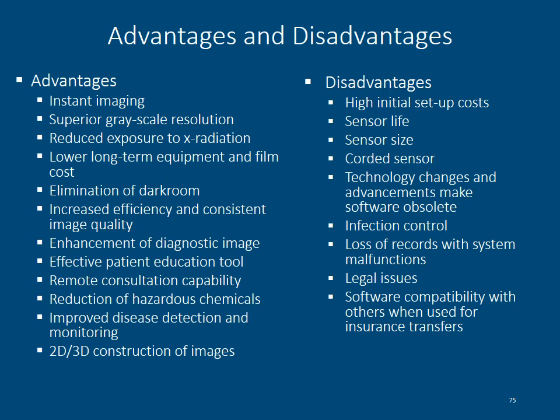The ability to send these images via the internet or digitally to another office, or to be consulted or reviewed by another dentist off-site, is a definite added benefit to digital imaging. It improves disease detection and monitoring because of all these other advantages. And it turns a 2D image into a possible 3D image. When looking at the disadvantages, it has a very high initial setup cost.